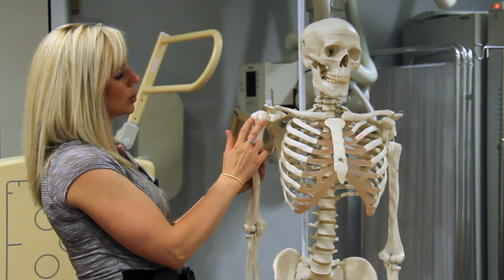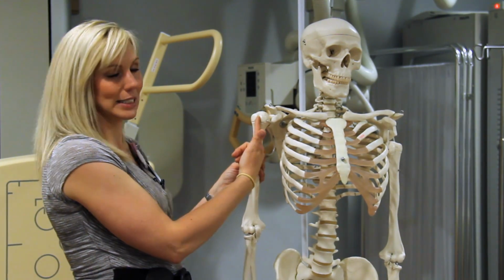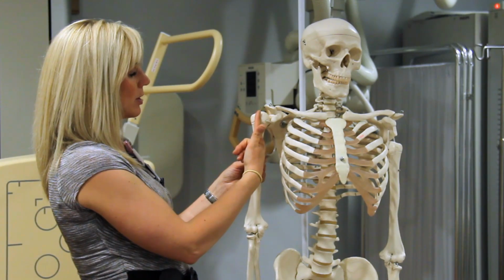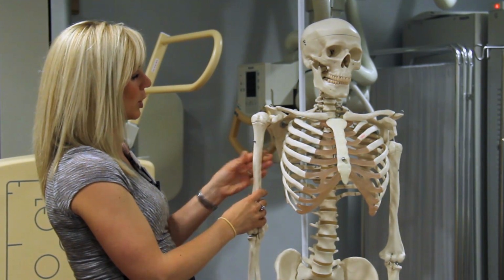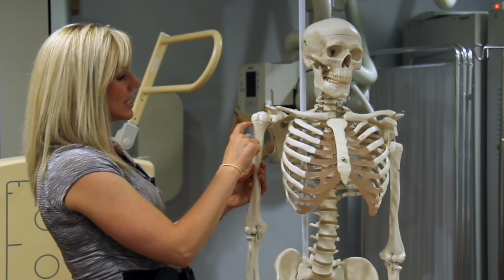Now, in between those two tubercles, we have a divot or a groove. It's called the bicipital groove or the intertubercular groove. And there are actual special projections that you could do to make sure that that groove is very open between those tubercles.